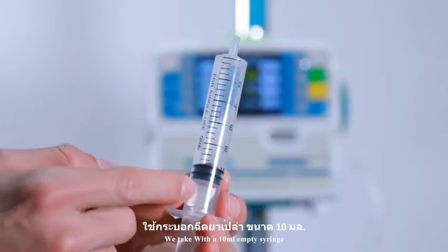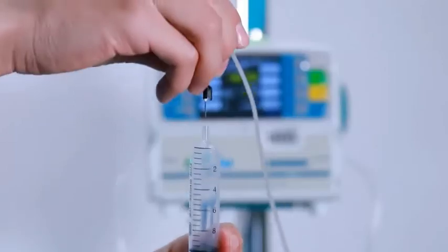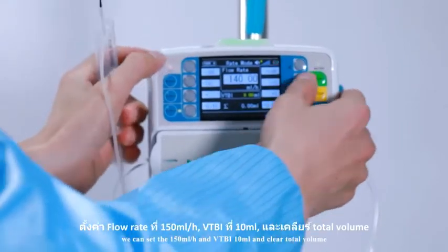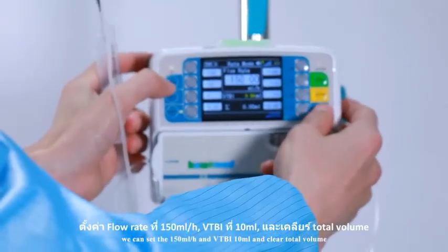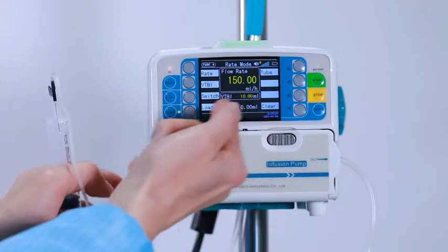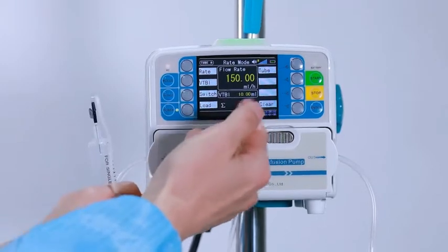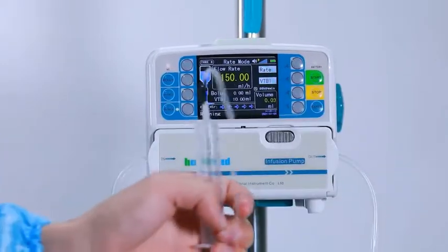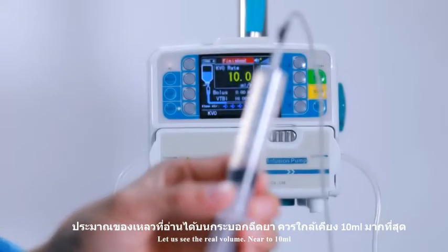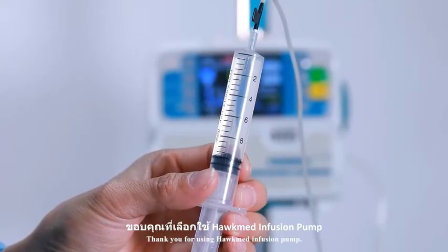We take a 10ml empty syringe and insert the needle. We can set 150ml per hour, VTBI 10ml, and clear the total volume. Then press start. Let us wait for 4 minutes and see the real volume — near to 10ml, 100% accuracy. Thank you for using Hawkmed infusion pump.